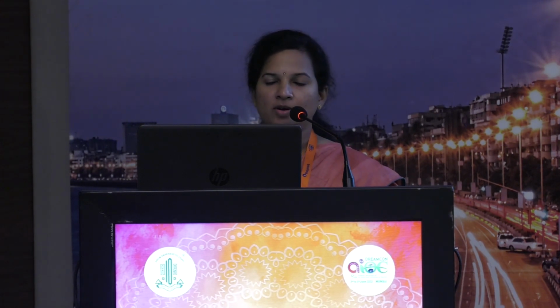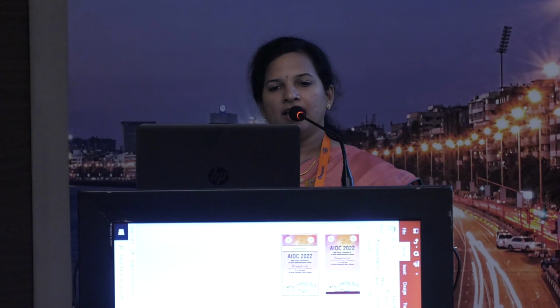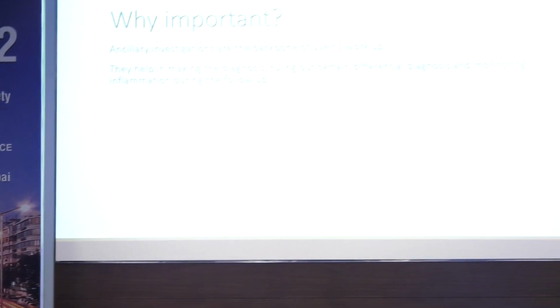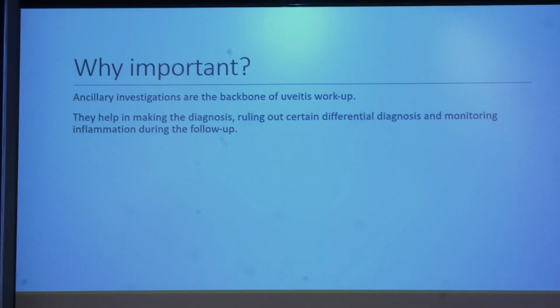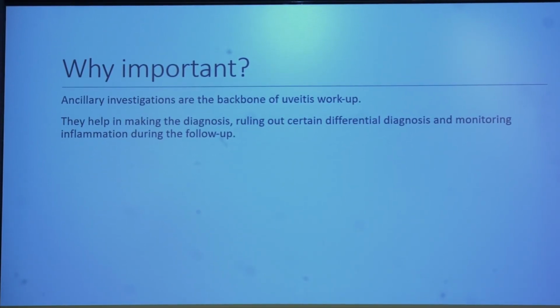I'll be talking about OCT, the role of OCT in uveitis. Why is it important? As we all know, ancillary investigations are the backbone of uveitis workup. They help in making the diagnosis and ruling out certain differential diagnoses, and also monitoring inflammation during follow-up.